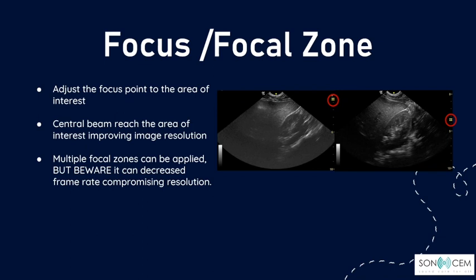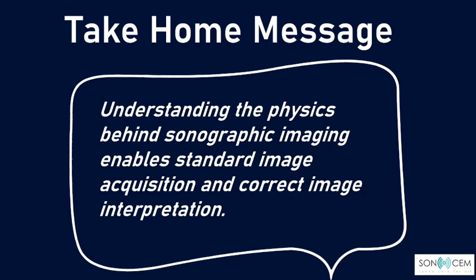Besides changing the position, the focal point can also be increased to more than one, but always keep in mind not to increase too much as it can backfire and reduce the image resolution. We have come to the end of this lecture. Do remember that understanding the physics behind sonographic imaging enables standard image acquisition and correct image interpretation.